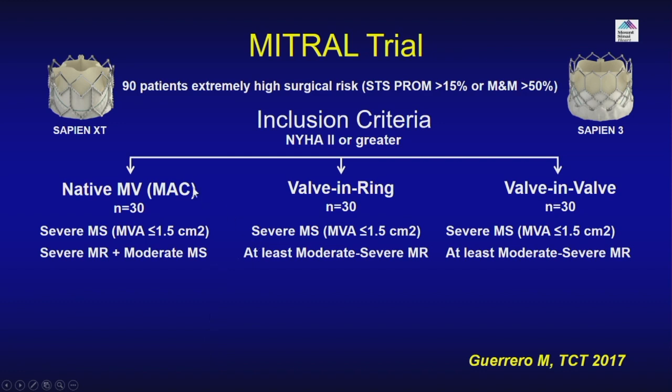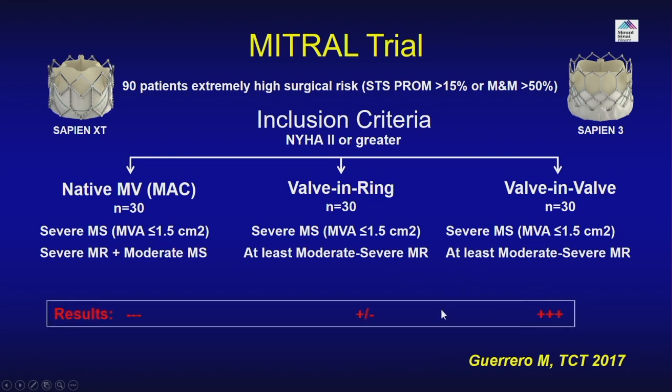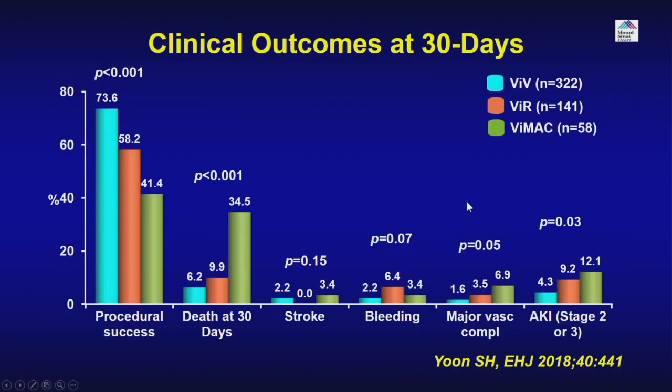Now, going on to that, there is a group of patients who could benefit from not clip, but for whatever reason that they could benefit from valve placement on the mitral area. But who are they? Patients who have calcific mitral annular calcification, which is called native MAC. If they already have a valve in mitral position, or they had a repair with a ring. So this was a trial that was presented in 2017, and subsequently you'll see the results of these patients.